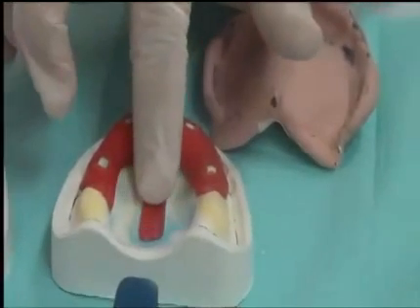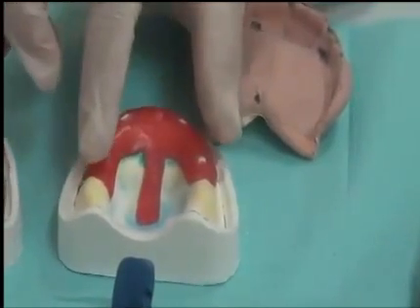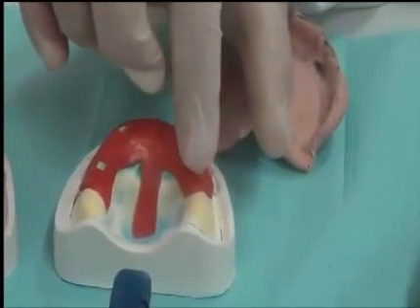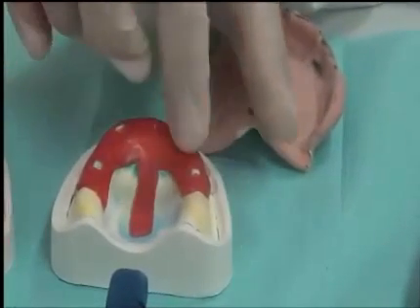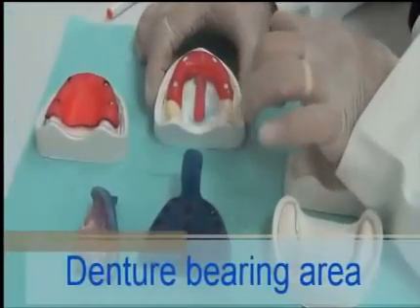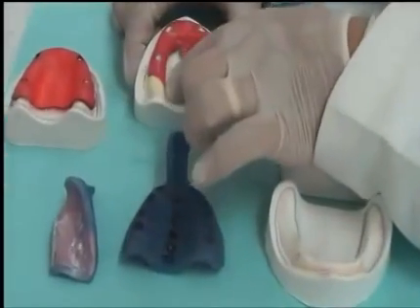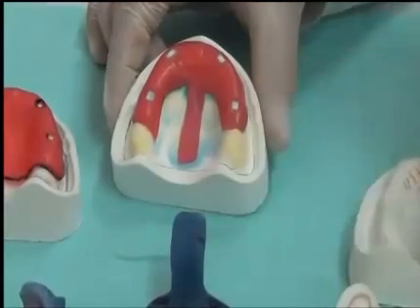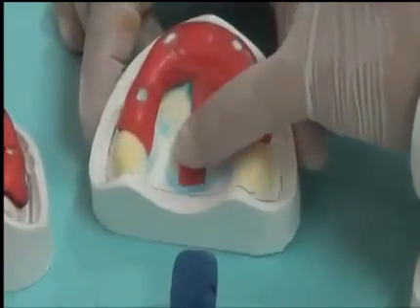In the areas where there is a spacer, the impression material will have space to set. It will not be squeezed firmly between the tray and the tissue, so we will have a mucostatic state of the impression material. So in these areas, we do not have pressure on the tissue. On this cast, you see that the denture-bearing area is divided into two parts: the areas that will be compressed, called primary support areas, and the areas that will be relieved, called relief areas.